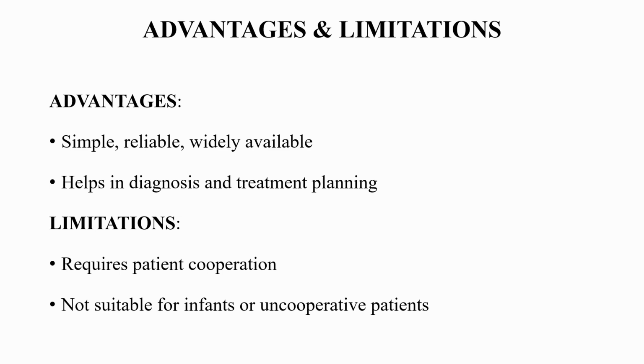So if patient response is not proper, then the result might not be fully correct. And secondly, this test is not suitable for infants or uncooperative patients. As it is in a closed soundproof room or booth, some patients have phobia of sitting in there, so they cannot undergo this type of test properly.